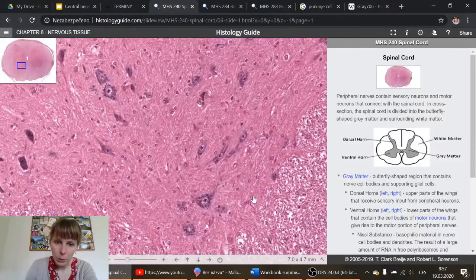So you have cell body, stained rough endoplasmic reticulum, nucleus with nucleolus. So this is how the huge motoneurons will look like. So these are the cells sitting in the spinal cord that will be responsible for making your muscles move when you want to. So Golgi type 1 multipolar neurons, and they are called motoneurons because they are responsible for your motorics.